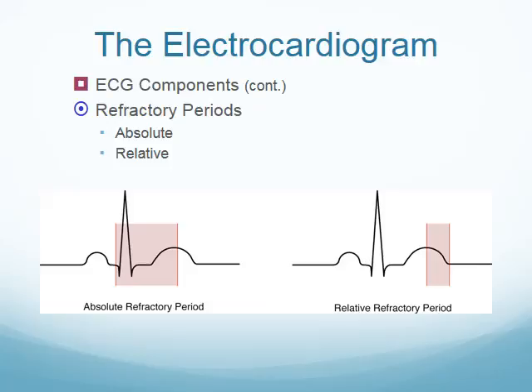So we need to be very concerned whenever we see patients that have beats occurring on or near the T wave, because it can precipitate sudden cardiac death in certain situations. That's something we'll talk about later on, the R on T phenomenon, and we'll get into it in more detail as we move forward.